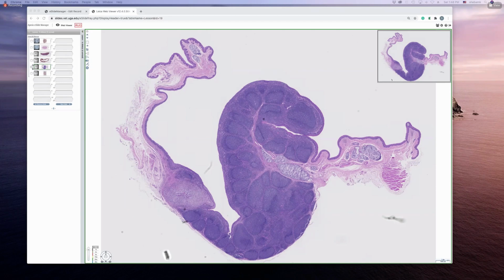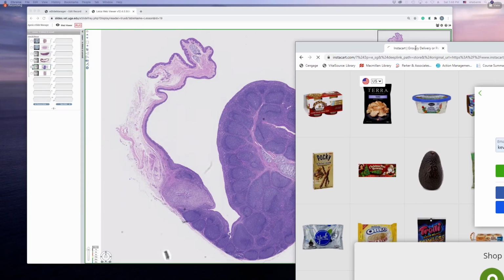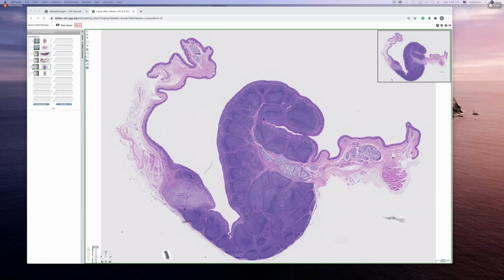Okay, GALT. B cell nodules. And anywhere in the lymphatic tissue, if you see nodules, are you going to see T or B cells in them? B cells. B cells will be in the nodules, and T cells will be in the diffuse lymphoid tissue. Okay.